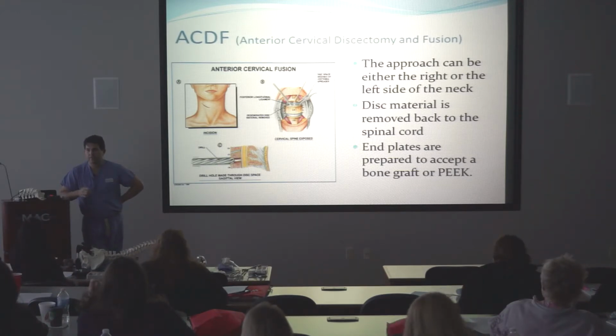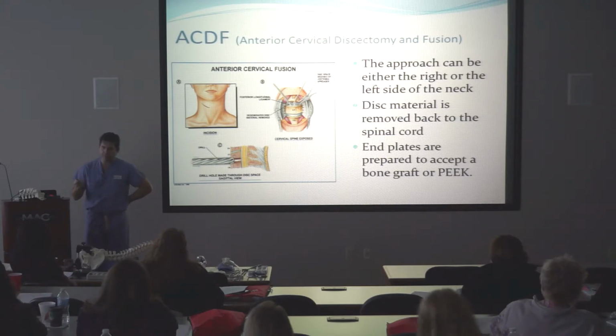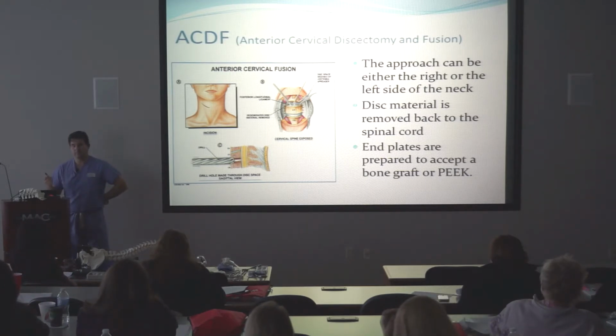It depends on where. In the lumbar spine, which is where they were really pushing artificial discs, because that's where most disc problems and a lot of the fusion stuff is going on, and you have problems with adjacent segment degeneration more in the lumbar spine because of the amount of weight that's going through the lumbar spine. So that was the big push for artificial disc replacements. Well, the disc that came out, the Charité, was the first one that came out, and it's got to be 2006 or so when it first started coming out.